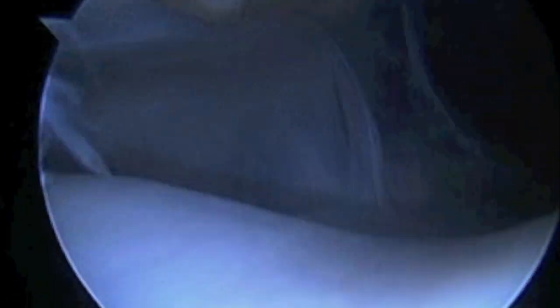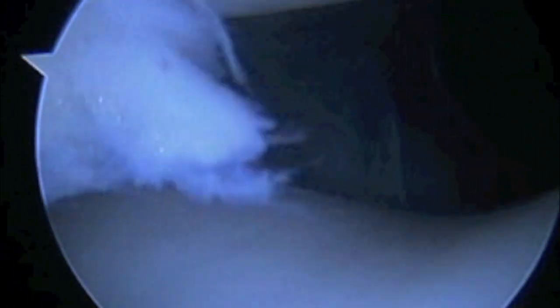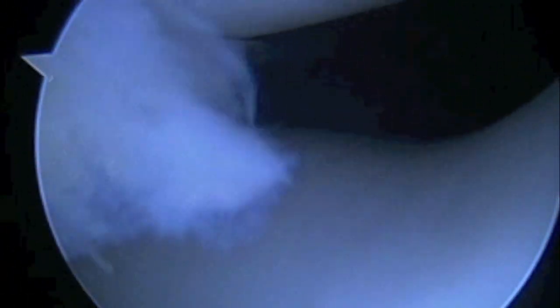Here at arthroscopy, you can see we have the camera inserted underneath the kneecap. To the top of the screen is the patella and inferiorly is the trochlea or the groove. As we bend the knee, you can begin to see how there's soft tissue entrapped between the kneecap and the groove. That soft tissue is the medial plica.